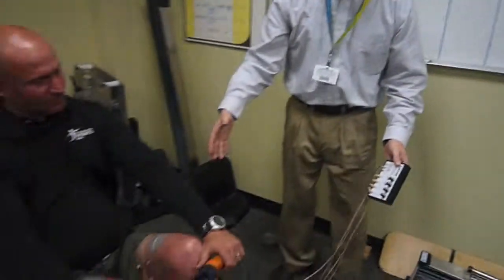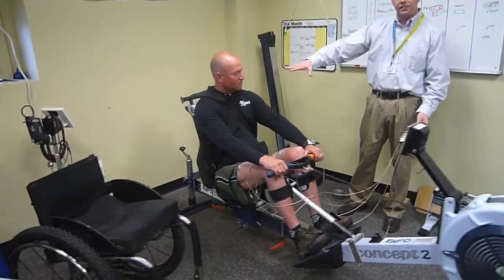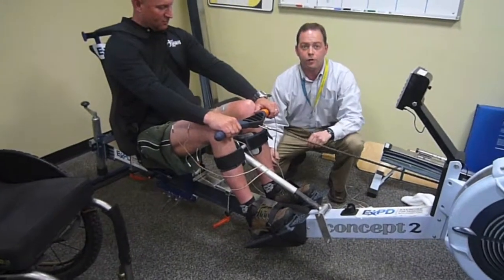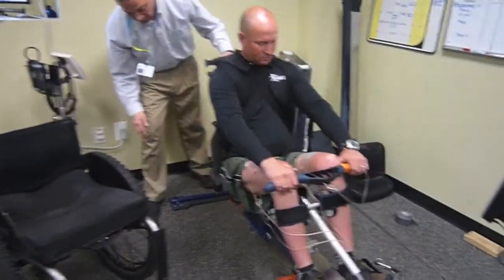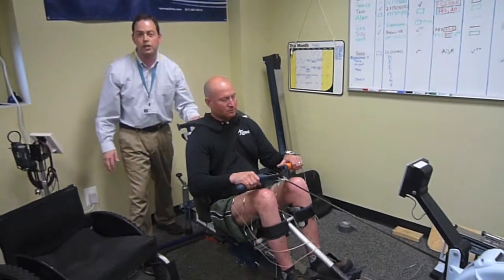This is the adapted rower. As you can see, he's in a high back seat. He's strapped in very well to keep him supported. He's got a leg support piece here to keep his legs from going side to side. And we have safety stops on the front and the back that help him from going in a range of motion that we don't want, and actually help him change direction too.